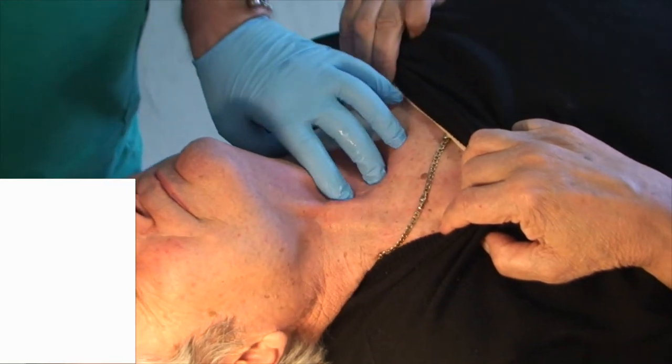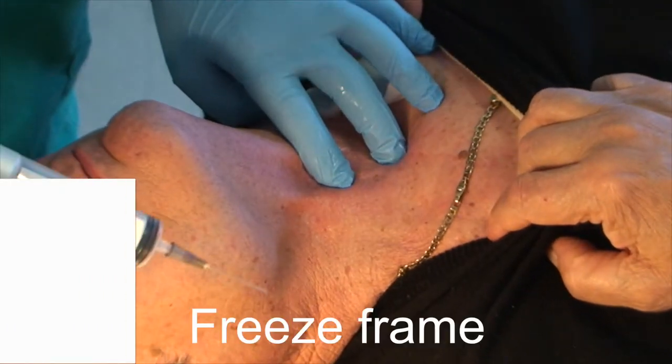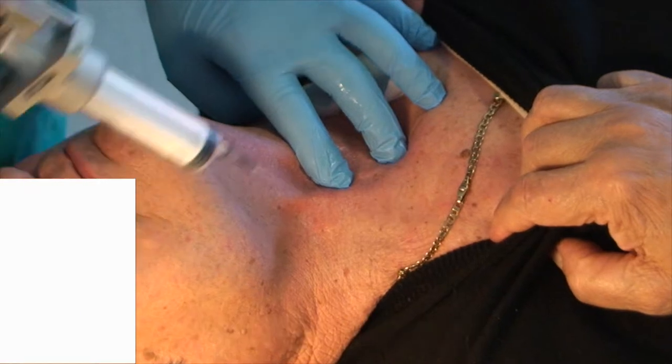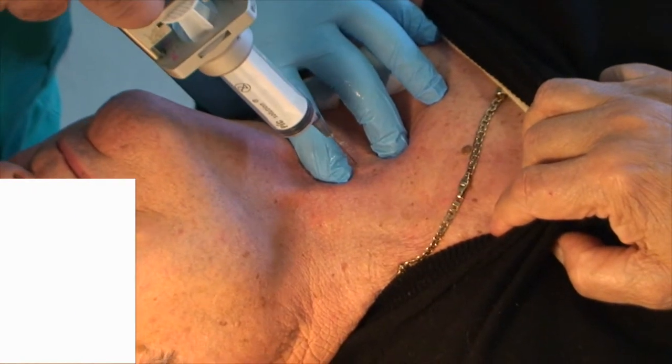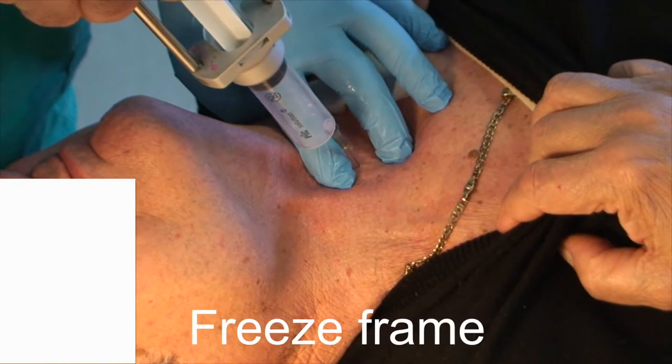There is no need for local anesthesia. After disinfecting the skin, the operator's dominant hand grasps the syringe. The other hand interlocks and immobilizes the node between the second and third fingers. The operator inserts the needle into the lesion at an angle of 65–70 degrees to the plane of the skin, in the direction of the patient's feet. As soon as the operator is sure that the tip of the needle has penetrated and is roughly in the middle of the lesion, he begins to aspirate, pulling up on the syringe plunger.